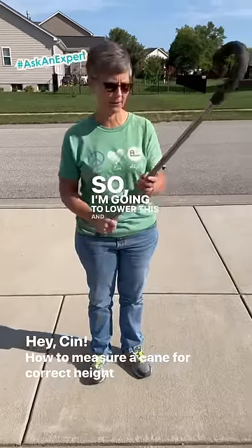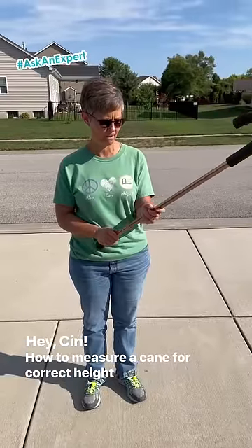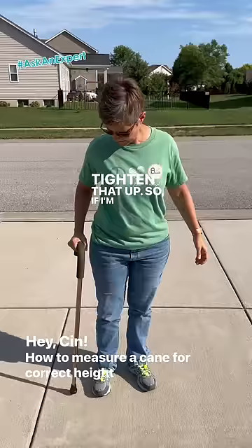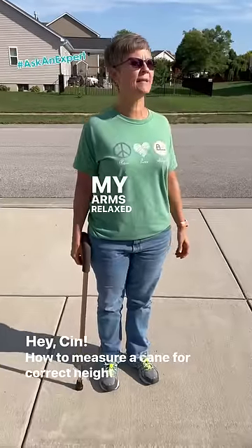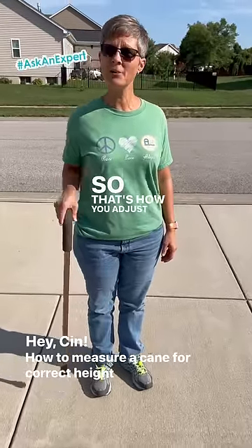So I'm going to lower this a couple notches for me. Tighten that up. So if I'm standing up nice and tall, my arms relaxed at my side, it's going to hit me at wrist level. So that's how you adjust the cane height.